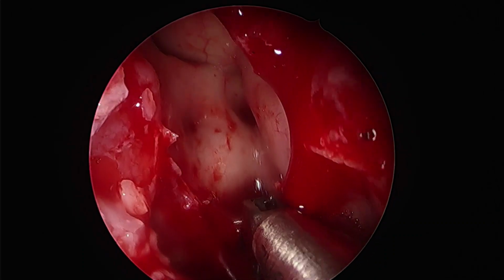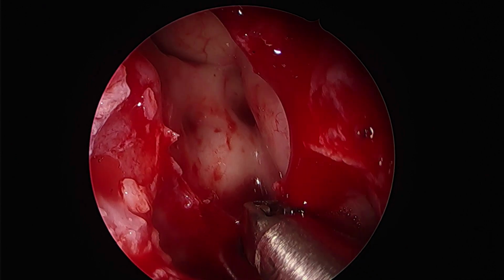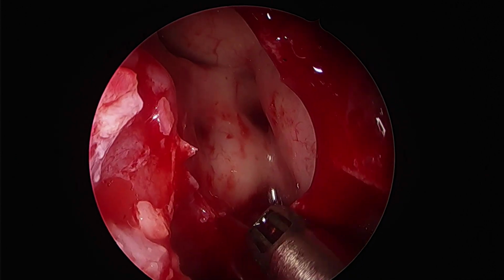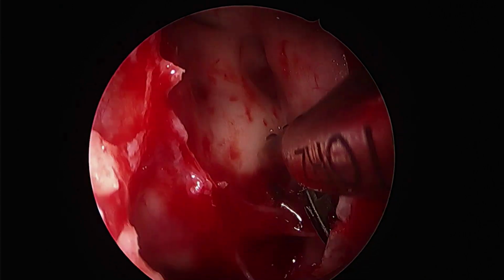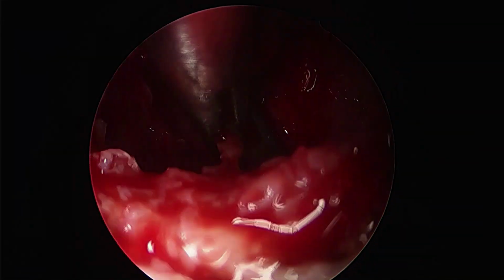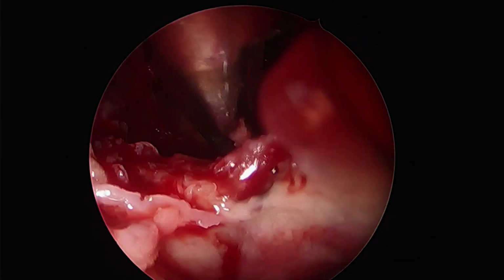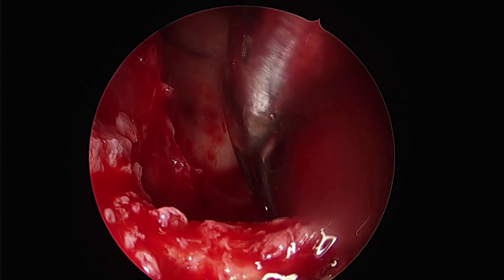Sharp and good quality through cutting instruments are the most fundamental part of any sinus surgery. One must have them in all forms of sizes and shapes. It could be straight, it could be a 45-degree turn, it could be in different sizes, as the bite size could vary depending on what applications you intend them for.